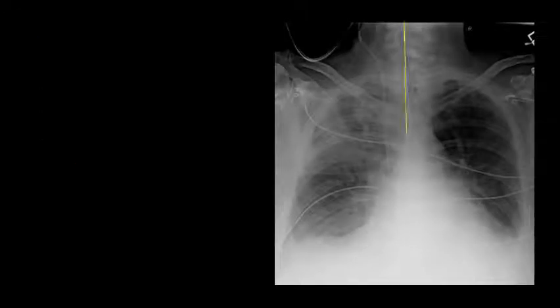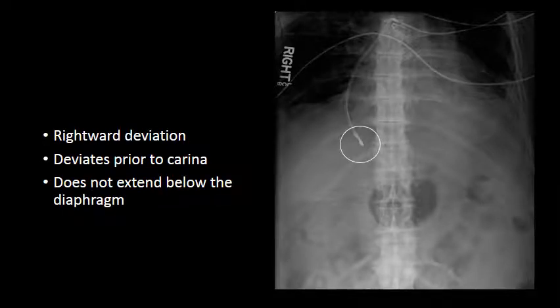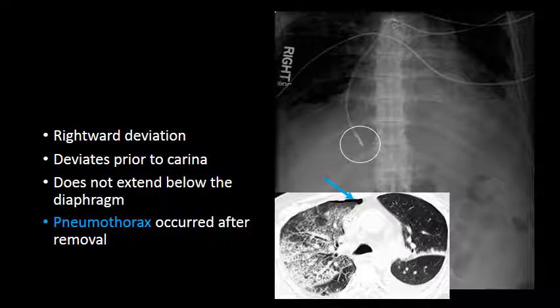Here's another example of a catheter which takes an abnormal course deviating to the right prior to the carina. On the abdominal film taken at the same time, we see this catheter does not pass below the diaphragm but instead goes into the right lower lobe, extending to the periphery. A deep catheter like this can sometimes result in a pneumothorax, and when pulling catheters that have reached the periphery of the lung, you should be ready for chest tube placement. The most severe complication is the development of a bronchopleural fistula should the catheter course through the bronchi out into the pleural space.